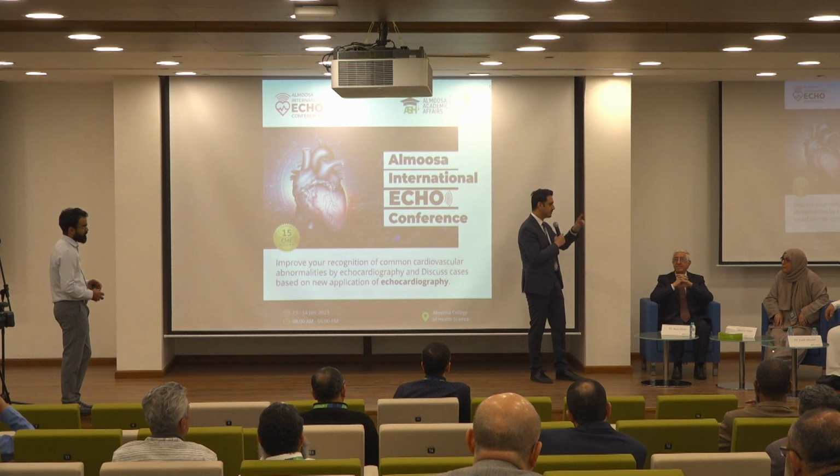For the two envelopes, for the DVI you could use it, but if you want the mean gradient or the peak velocity, it's always best to take the densest signal without having two envelopes in it. Also, we talk about mean aortic stenosis gradient, which will correlate with the cath numbers, right? Most of the time, as cardiologists, please correct me, we don't go by the peak alone; we always get both peak and mean, and decide whether to send for cath or surgery.